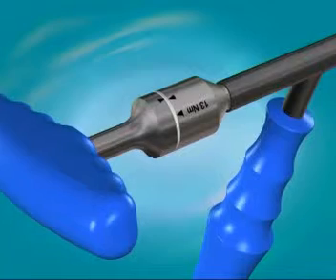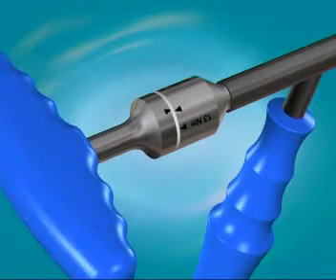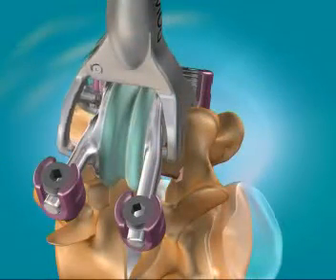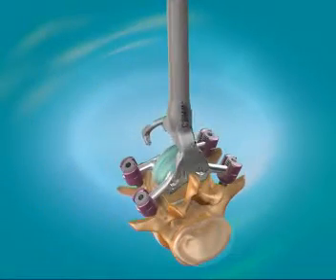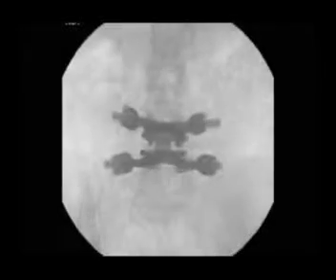Tighten the 4 set screws to 13 Newton meters using the torque wrench and the counter wrench. Remove the holder from the TOPS by turning the knob counterclockwise to open the tongs. Verify final positioning with an X-ray. Verify that all instrumentation has been removed from the surgical field prior to closing the incision using standard surgical technique.